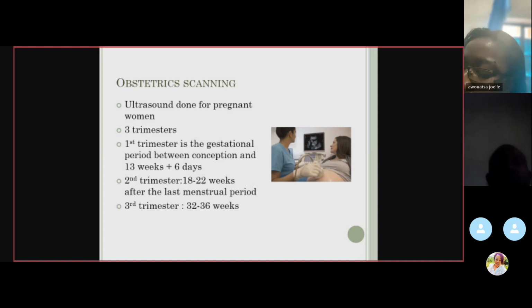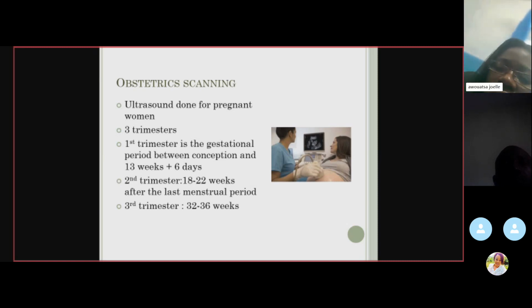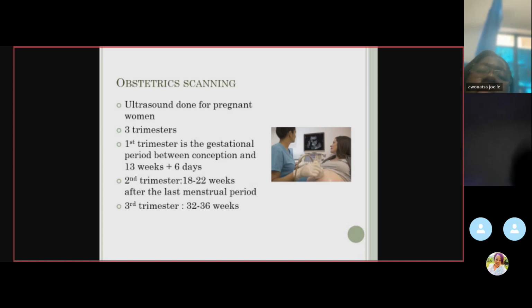We can calculate that after 9 months it will show the exact date, and with the measurements taken on the ultrasound machine, on that basis also we can get the delivery date, the expected delivery date. So it is very important to mention this LMP. Here we have to mention the patient details, age, name, ID, and the LMP.